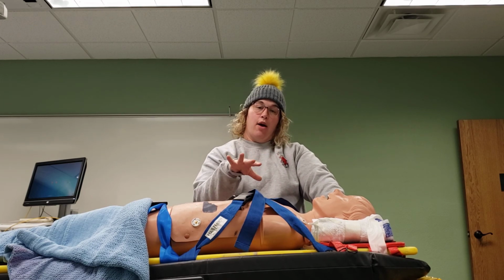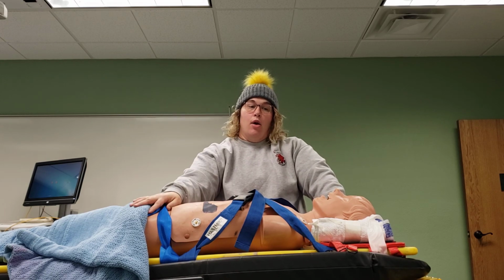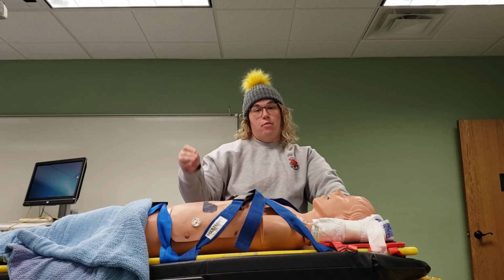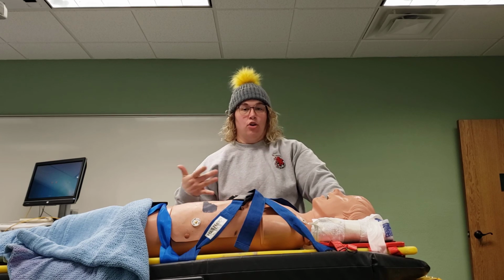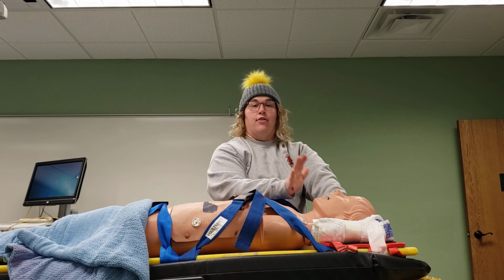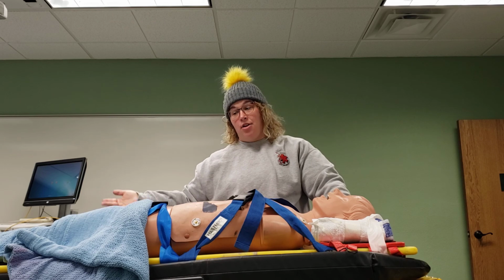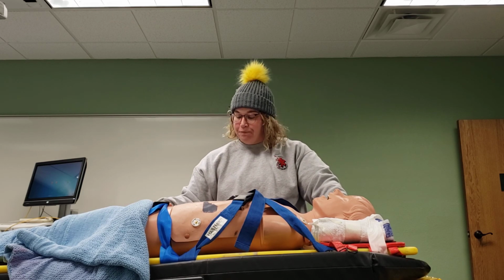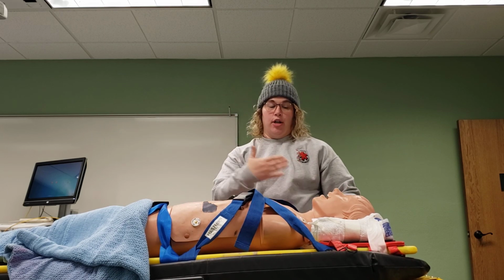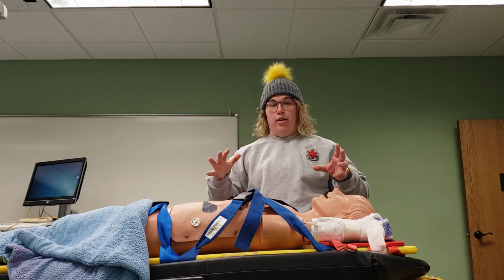Moving from a lower amount of oxygenation intervention to the highest amount would be the advanced airway. Whether you're a basic or an advanced, you want to always focus on the least invasive to the most. We don't just jump to the most invasive because we can do it. That doesn't make you a good provider. Even I, as a paramedic, should be able to intervene at a basic level before I'm going to the ultimate step. And if I'm just skipping because I can do it, then that may not be what's best for the patient. So good quality compressions, getting that AED on in the right formation, securing the airway as appropriate. That's what those skills are really about.